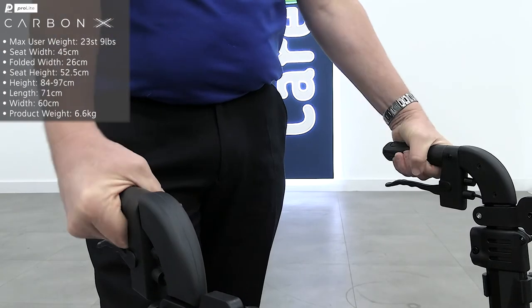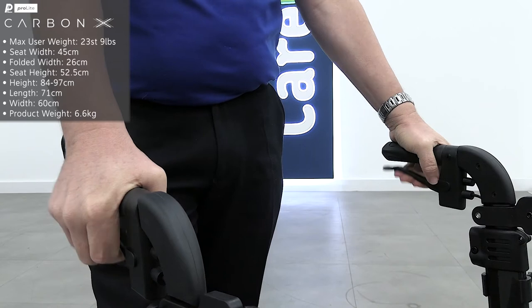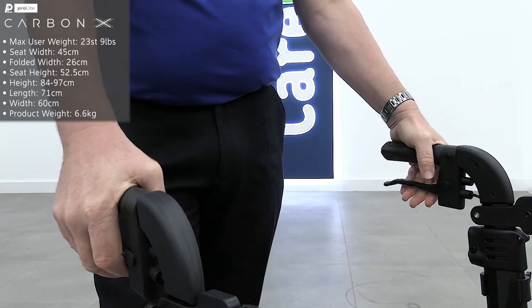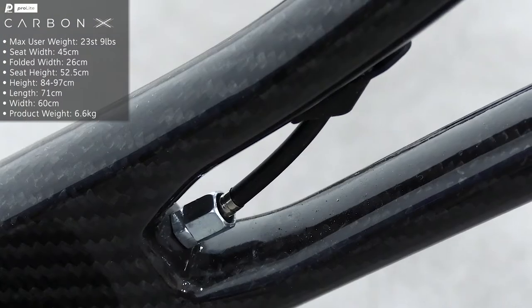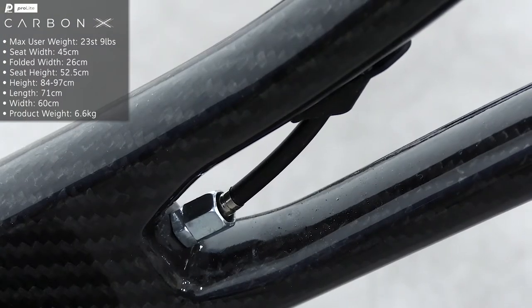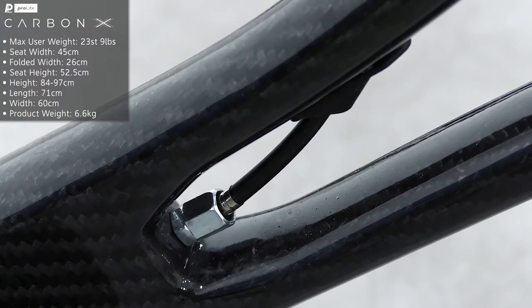Ergonomic handles stop pressure from building in your wrists while you walk, with easy grip locking brakes underneath just in case. The brake cables are hidden inside the frame for a stylish touch that also stops the cables from snagging on anything while you walk.